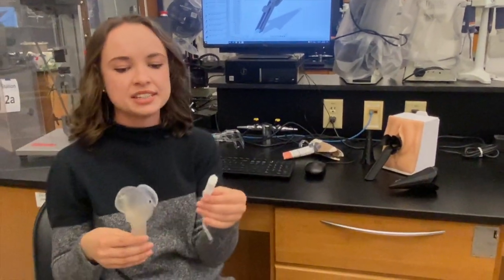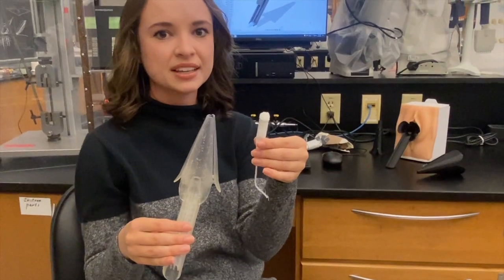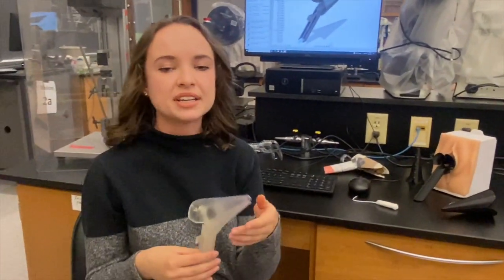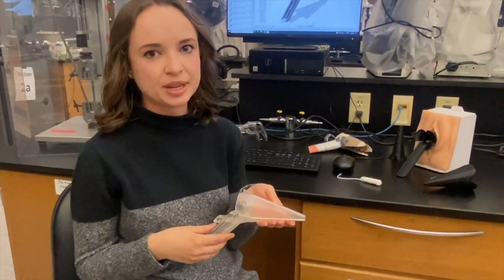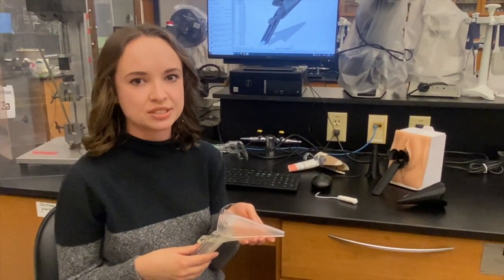To begin, the tip of the speculum is the width of a regular-sized tampon. This allows for ease of insertion and comfort of the patient during use. It also eliminates the need for rotation once the speculum has been inserted.